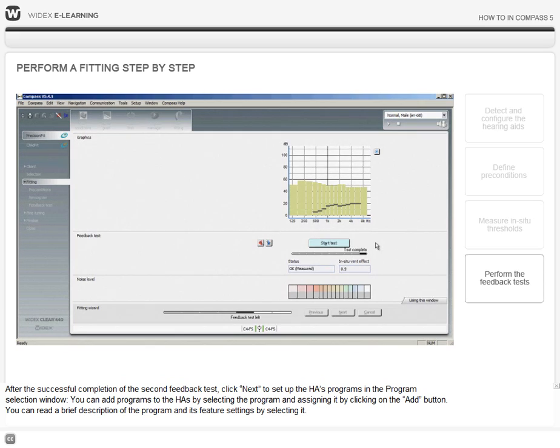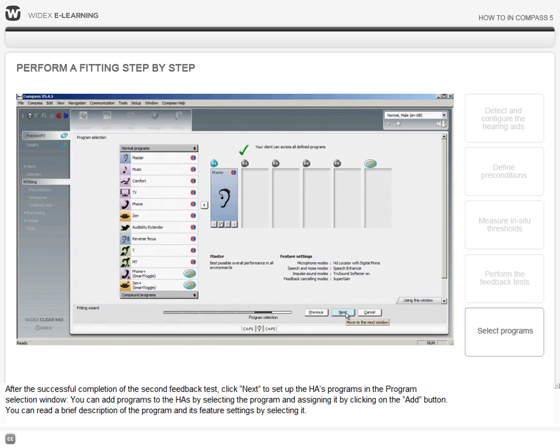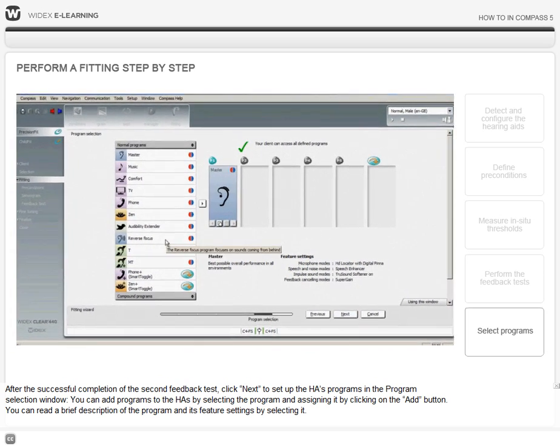After the successful completion of the second feedback test, click Next to set up the hearing aids programs in the program selection window.